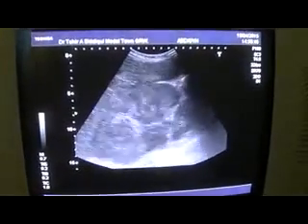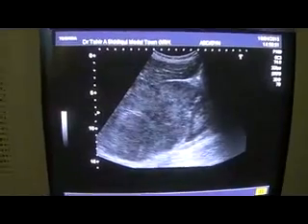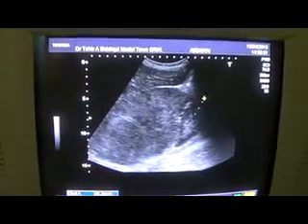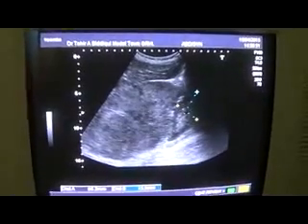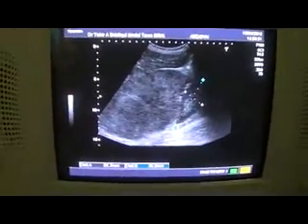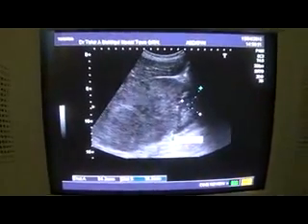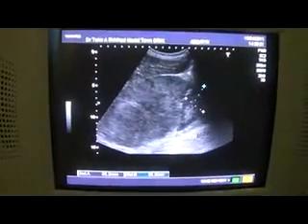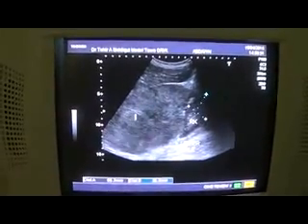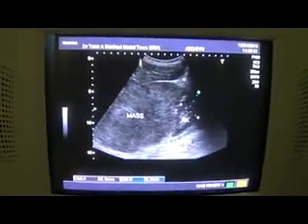The retroperitoneal fat line is rather displaced posteriorly. This mass — if you see — this is the kidney. It is not relating to the kidney from this scanning plane. This is the upper pole of the right kidney, and this is the mass. All of this is mass, whereas this is the liver.